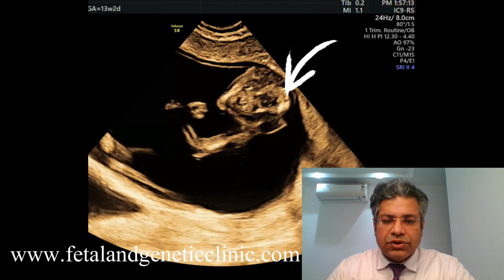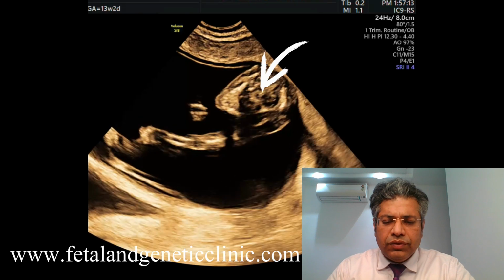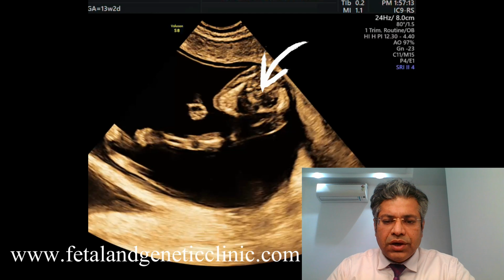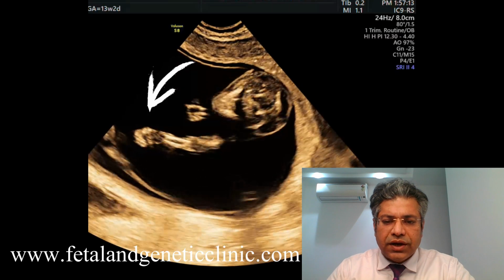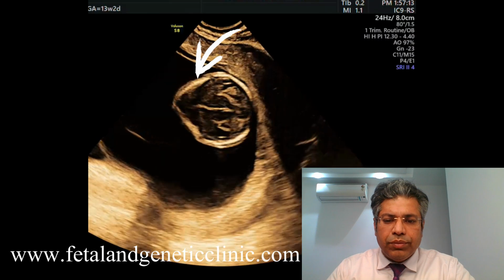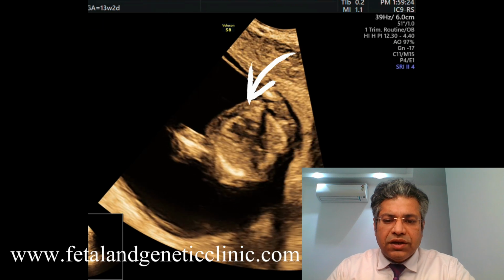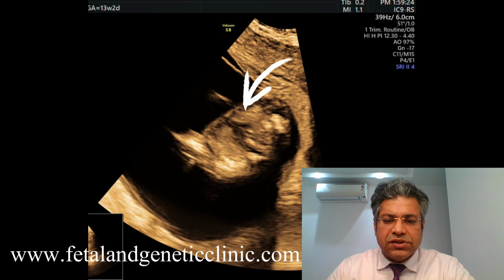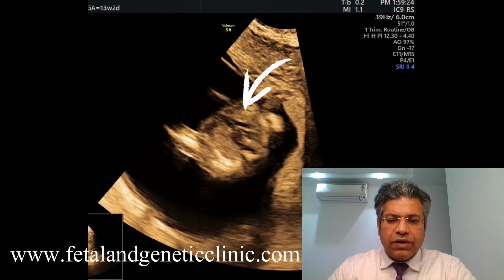And this is the increased nuchal translucency, just short of a cystic hygroma. And so probably cystic hygroma we can talk about, but it is increased nuchal, and then the fingers, the baby is not opening up the fingers, right? Okay, so the clenched fingers, and then we see the strawberry skull, then the cardiac large VSD, and then we can identify that both the great vessels are arising from the RV, so this is the DORV, right?